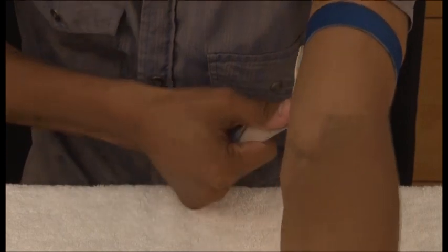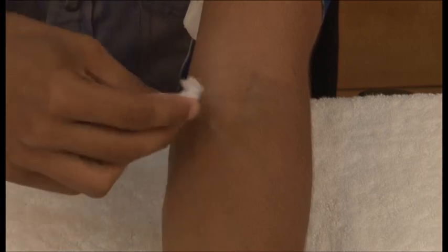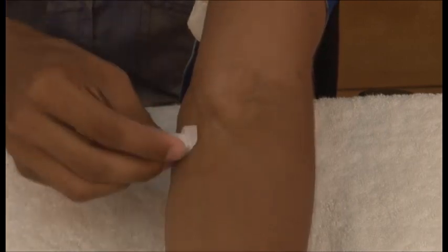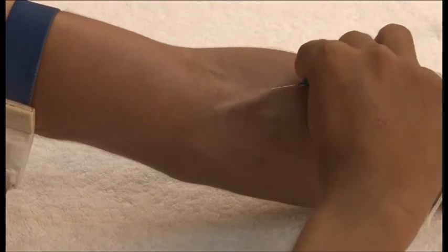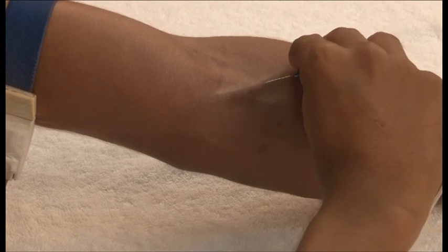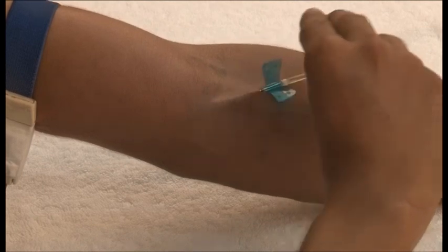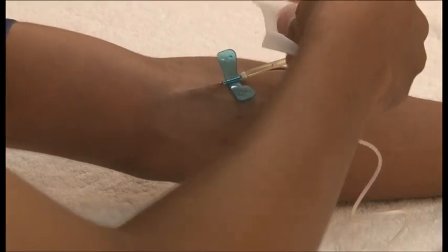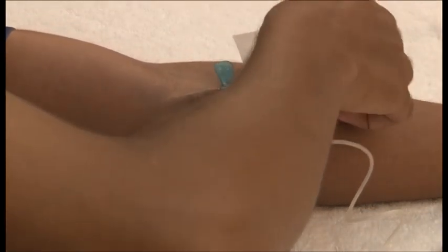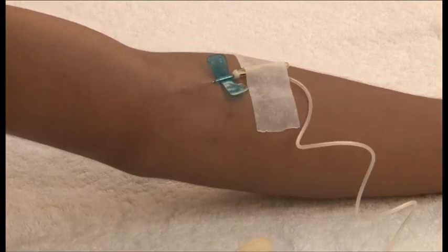Put on the tourniquet. Tap the vein selected for infusion and then disinfect the injection site with an alcohol swab. Insert the butterfly needle with the bevel facing upwards. Secure the butterfly needle with adhesive tape, then undo the tourniquet.